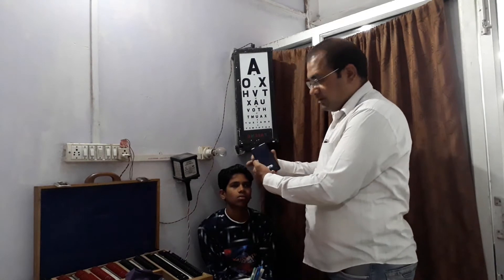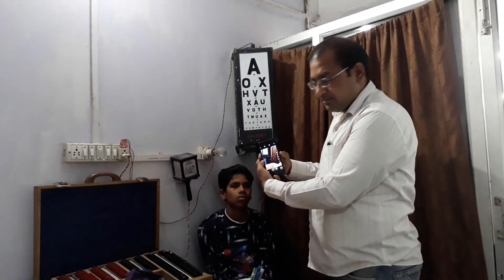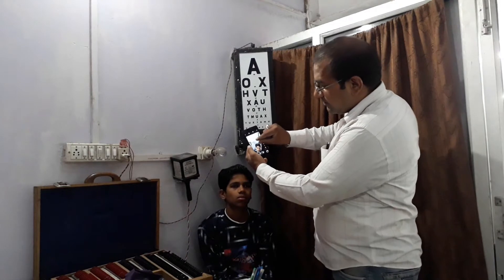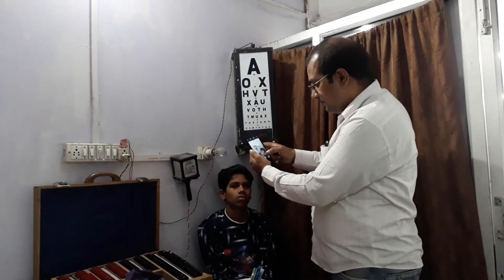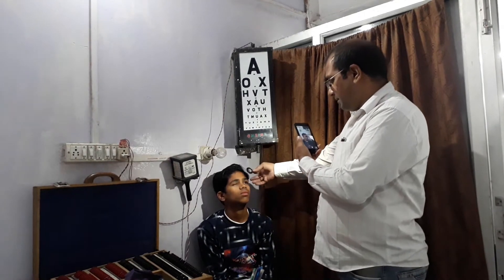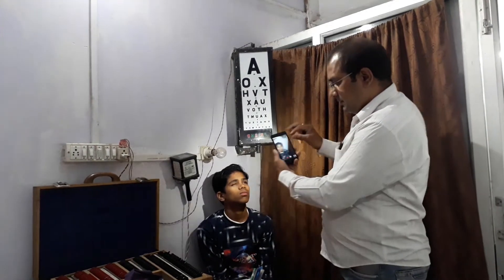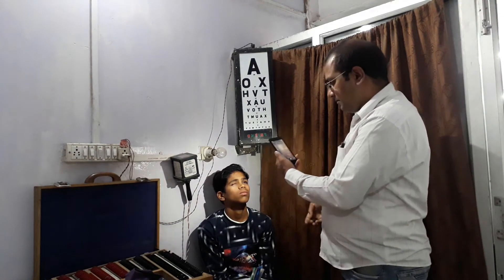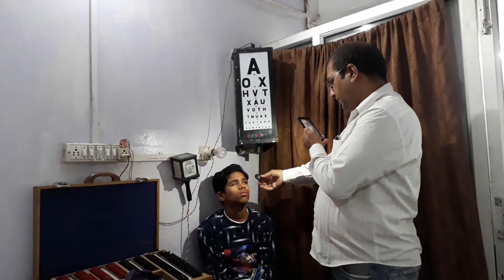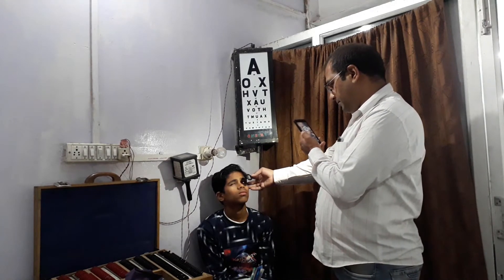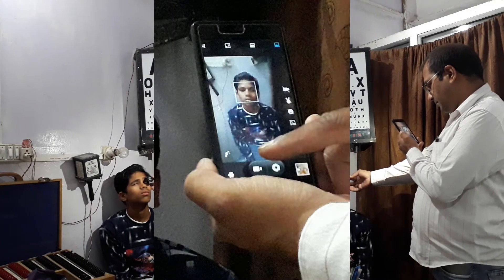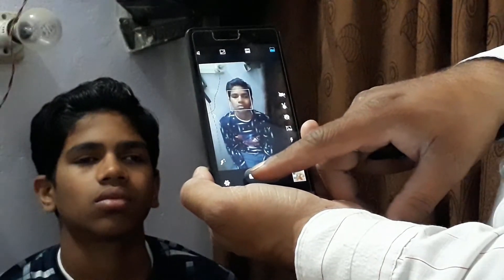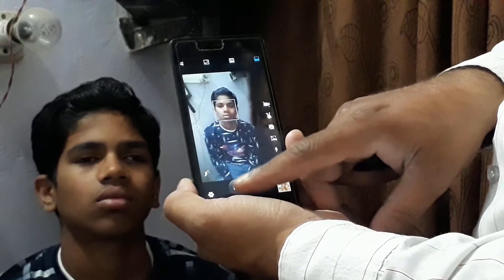The patient should be seated in a comfortable position for easy access to the eye. Take your smartphone in one hand and the 20D trial lens in the other hand. Switch on the camera of your phone and make sure that the flash of the camera is continuously on throughout the video recording. Set the camera at the patient's eye — the distance of the camera from the eye should be about arm's length.